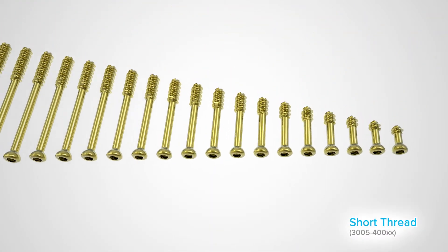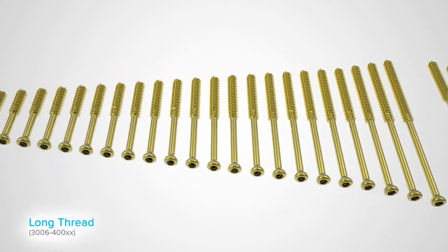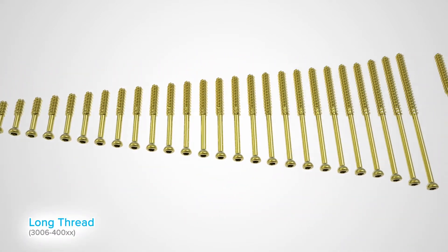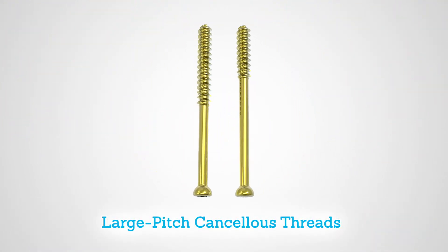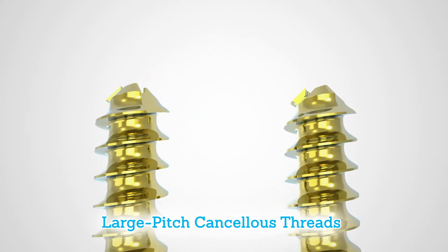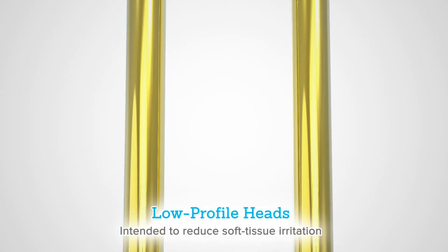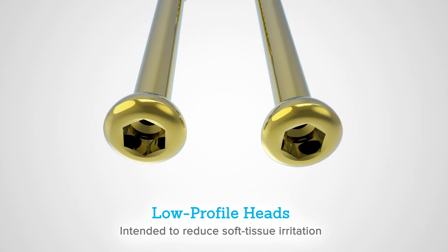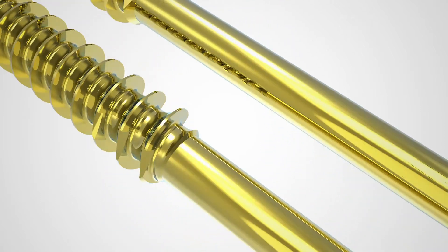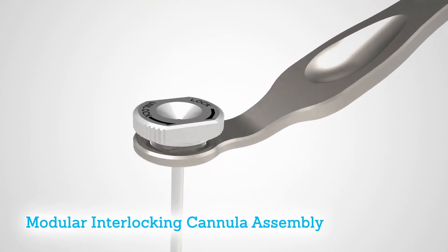The 4.0 millimeter cannulated screw system hosts screw lengths from 10 to 72 millimeters with two options for thread types: short and long. The screws are designed with large pitch cancellous threads intended to facilitate screw insertion and maximize purchase in cancellous bone. Low profile heads are intended to reduce soft tissue irritation when compared to standard screw heads. These 4.0 millimeter screws feature cutting flutes for self-drilling and self-tapping.